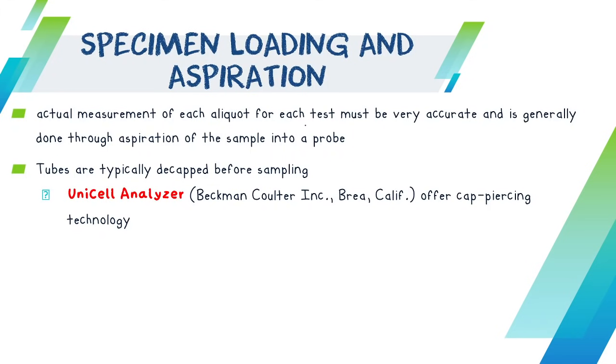But there are machines na no need for you to decap. Siya na bahala, naa silay cap piercing technology. So an example for that is your Unicel analyzer, which is from your Beckman Coulter. And isa sa best example na ako mahatag ani, other than your Unicel analyzer that has a cap piercing technology, that would be your hematology analyzers.